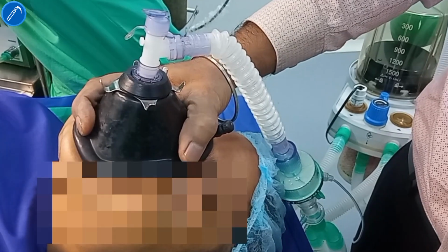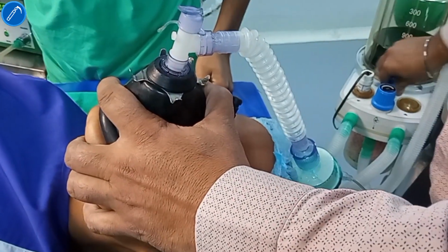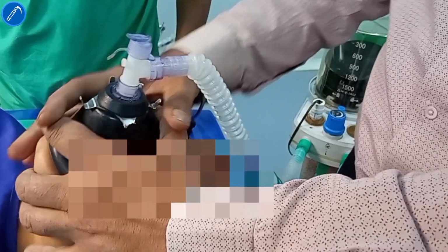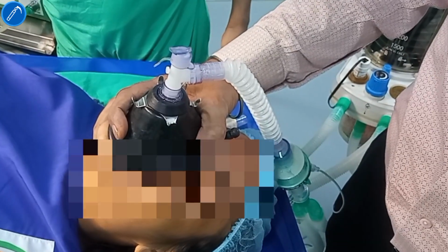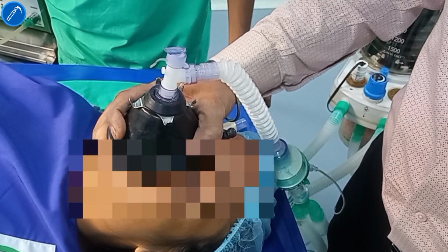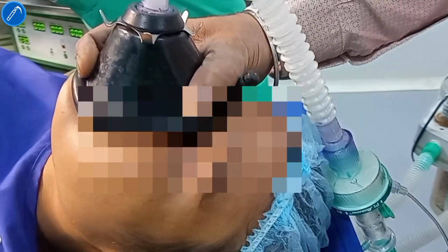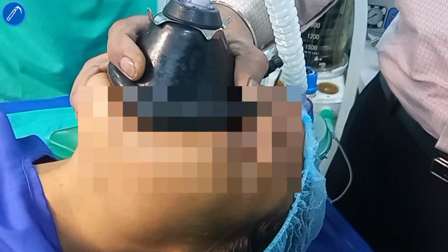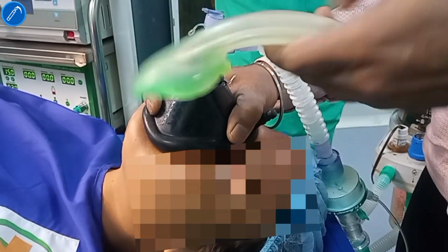This patient is posted for laparoscopic cholecystectomy. I'm getting it done under iGel. First I am doing bag and mask ventilation. You can see the mask connected with the circuit of the machine workstation. After doing bag and mask ventilation for 3 minutes, now this is the iGel. You can see the size is also mentioned on the iGel. First we will apply jelly.